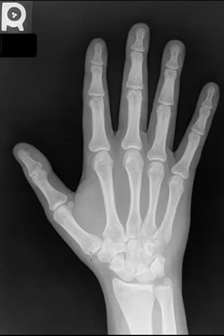Moving on, these articulations are the carpo-metacarpal joints. They are between the carpals, which we just discussed, and the metacarpals. Now, the common joint between them, again, is called the carpo-metacarpal joint. Now the metacarpals, there are 5, have 3 distinct areas that we like to discuss.